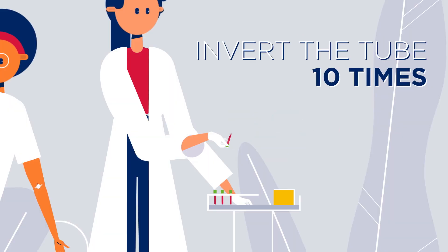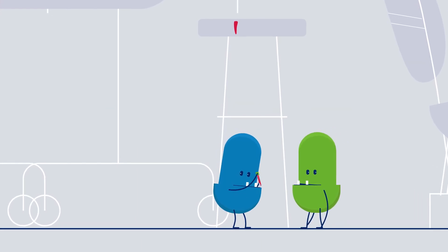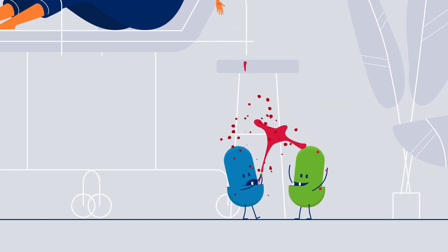Do invert the tube ten times. Don't shake the vial, as this breaks the blood cells. This is hemolysis.